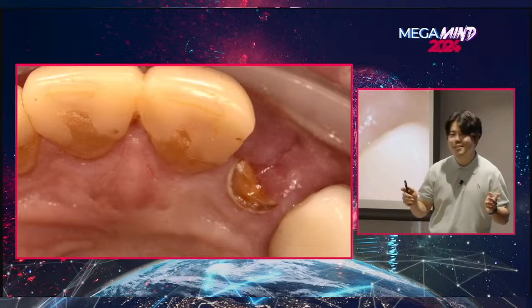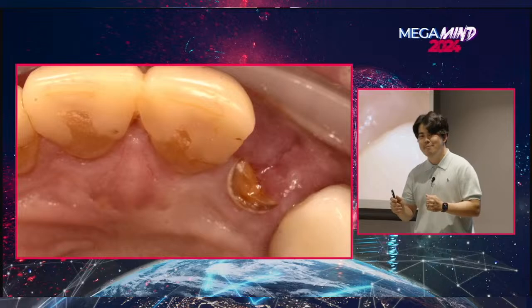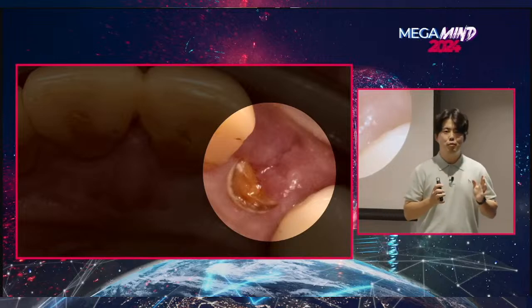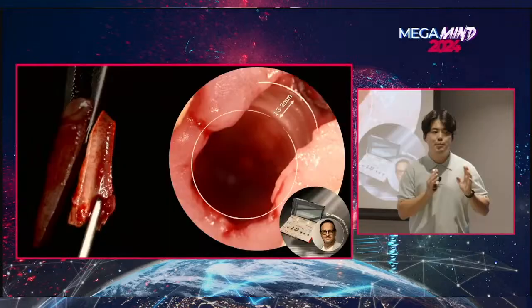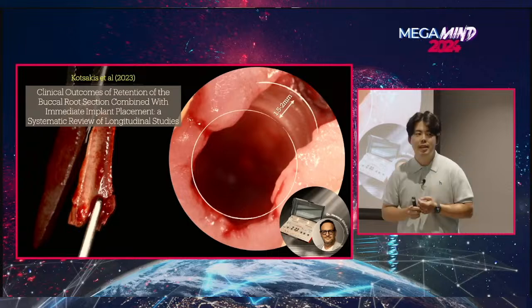So we start with the challenge of removing a tooth, leaving a root tip inside. It's counterintuitive, but I confess, I have left root tips inside before, but it was never intentional like this. Okay, so in order to do this, we follow a certain protocol. The protocol that I follow is the PET kit from MEGA'MIND. And this kit has specific drills for partial extraction therapy.